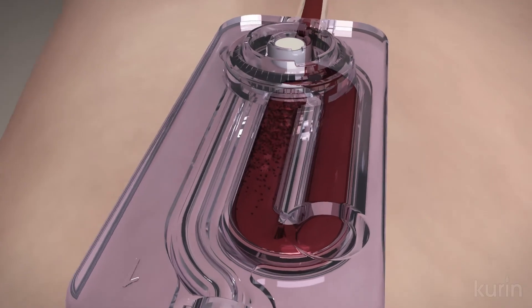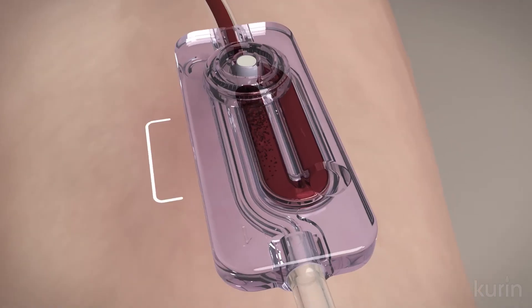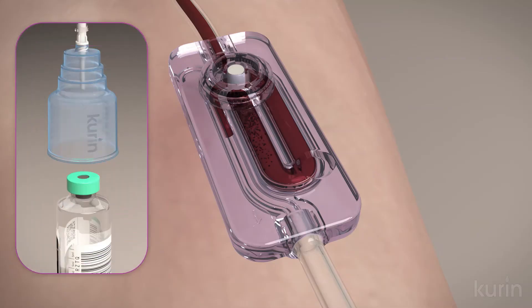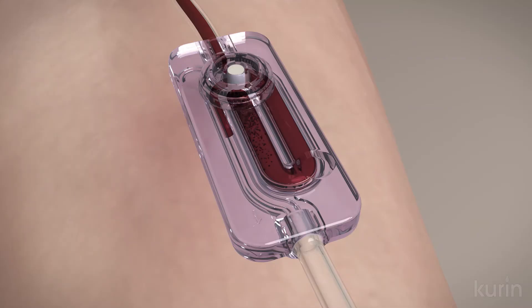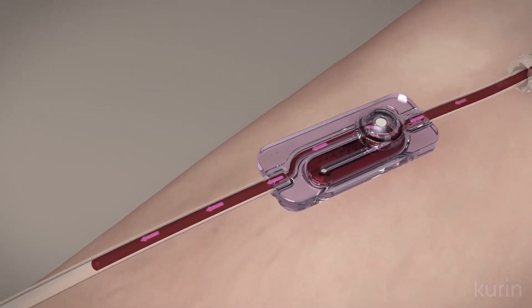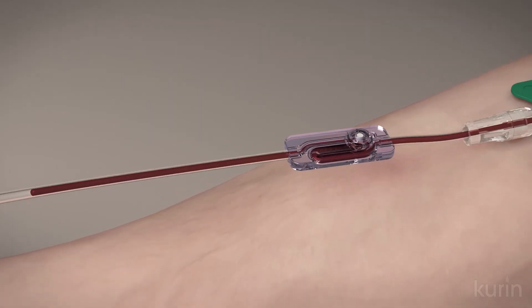Once the side channel is full, blood will flow a variable distance into the adjoining sampling channel before stopping. This indicates that the set is ready for specimen collection. When a vacuum is applied, blood then passes from the vein into the collection device through the sampling channel.